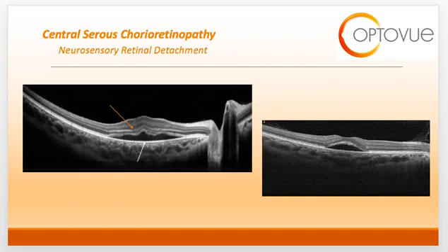The borders of the detachment may be regular, as seen on the right-hand scan, or irregular, as seen on the left-hand scan. It is important to remember that with CSR, the leakage occurs above the RPE. This will be important when we discuss differentiating CSR from other entities.